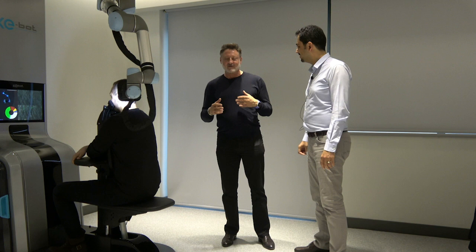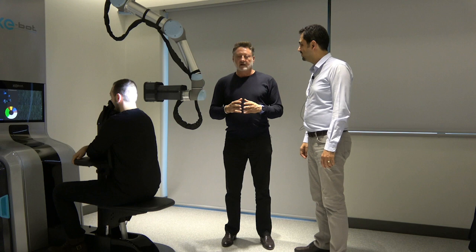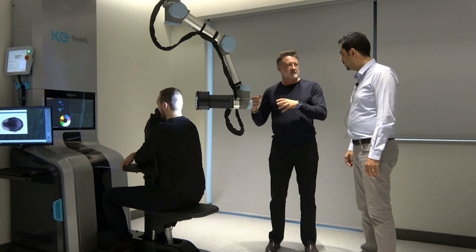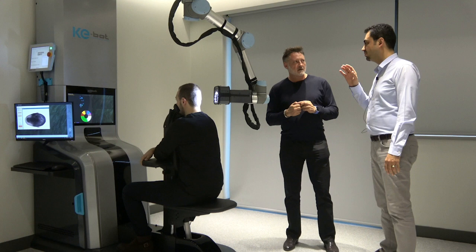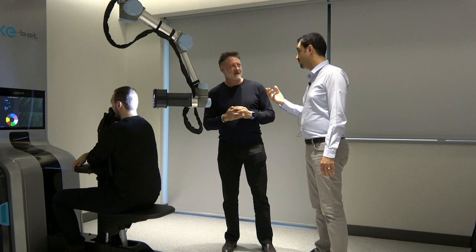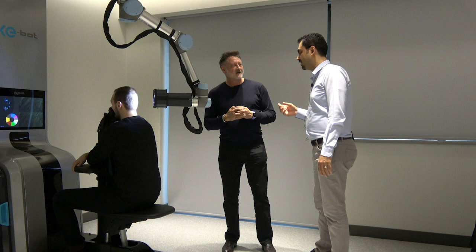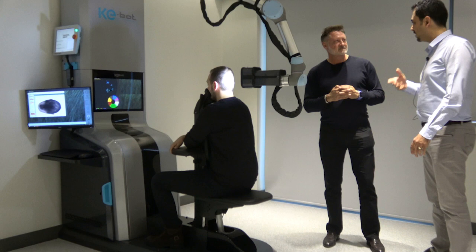One of the greatest drawbacks is that if the patient moves, it distorts the accuracy of the data. We expect the patient to stand still during scanning because after generating the 3D model we position the robot according to that initial data. If he moves, it will affect our calculations a little bit. We can actually track the head, but it will increase time — we're planning that as future work.